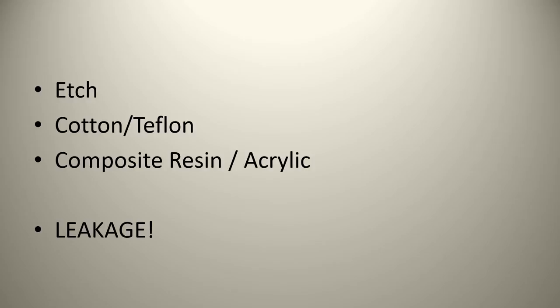And the main purpose here is we don't want any leakage, because leakage can be a problem at the level of the implant abutment interface, especially if there's micro movement in this area. And there will be some further research studies in this area conducted to hypothesize that this may be something which is related to the incidences of peri-implant diseases.